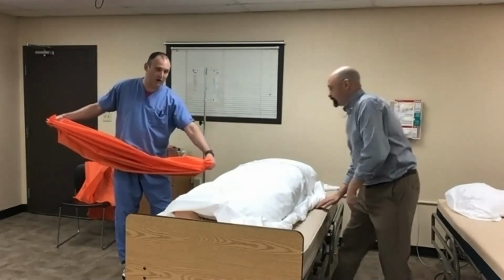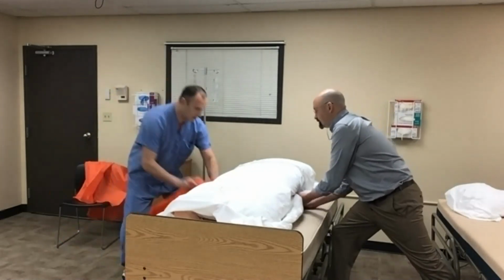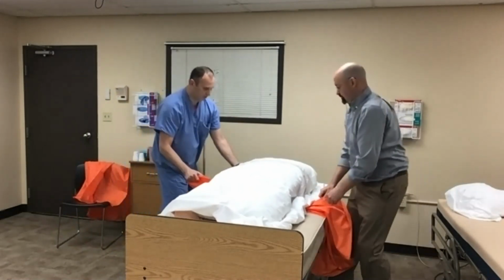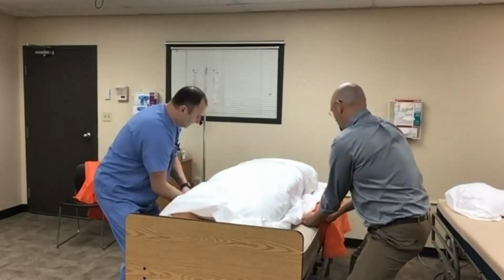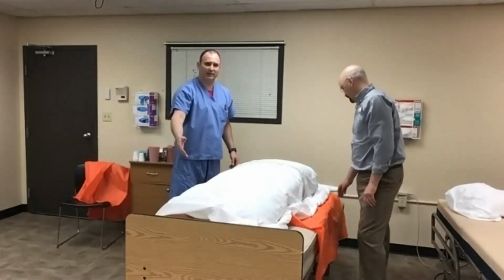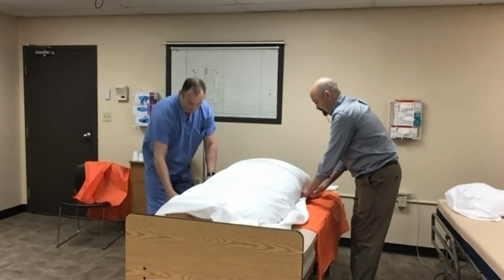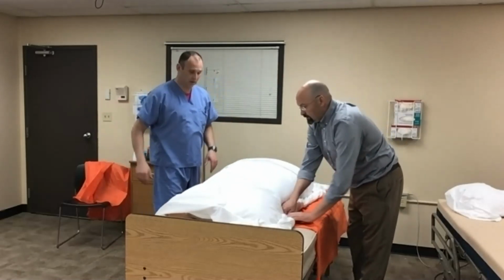We're going to pass this underneath the lumbar spine where there's a natural curve. So I'm literally just taking this, shoving it under to Chris, who grabs the end, okay? We're going to take this end together. We're going to slide it up. We're going to take the other end and slide it down. Okay, now, there would be a fitted sheet on the mattress. We don't have that currently, but there would be one there. So we've got enough slide sheet on either side because of the width of the bariatric slide sheet.